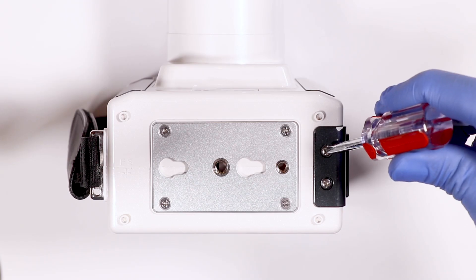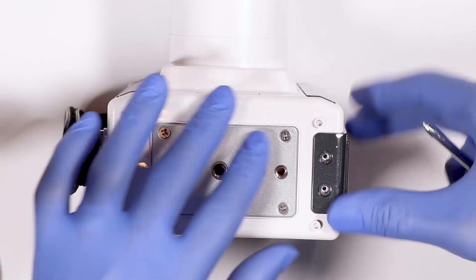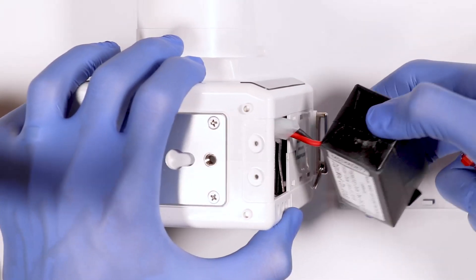Battery replacement: simply remove the two screws on the bottom of the XTG, remove the battery, and replace. This can be done in office.